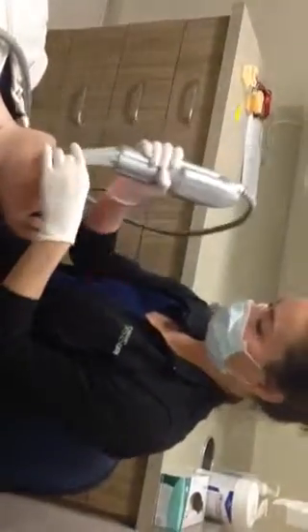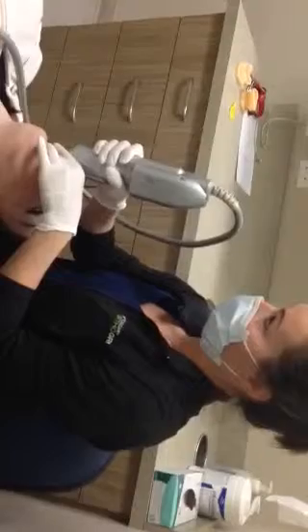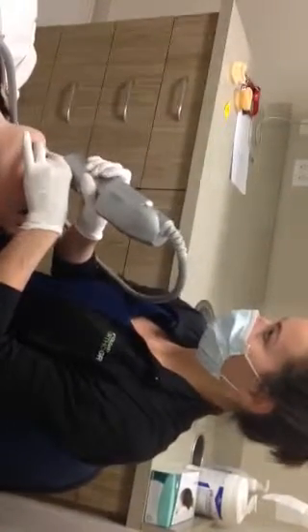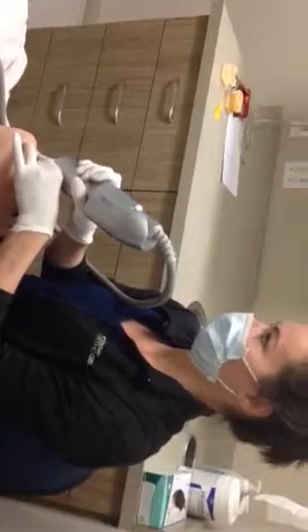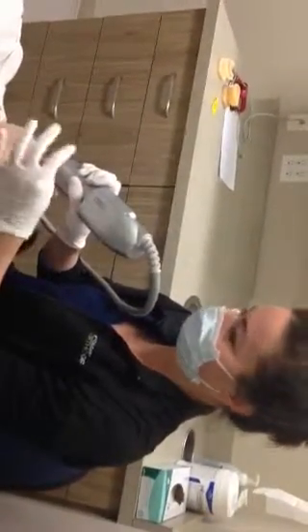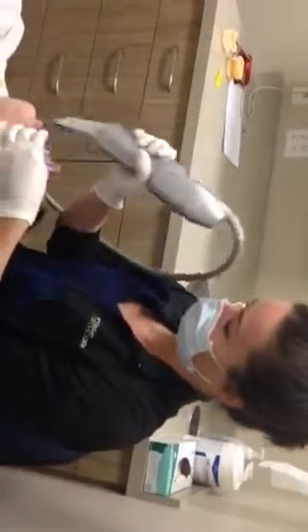Also the accuracy, I'd say, and you're never really sure if your alginate's going to turn out, right, like bubbles and voids, whereas this is like 100% accurate all the time. There's like thousands of tiny little reference points and these little laser lights. So, pretty accurate. Sorry, it's not picking up that too thick.